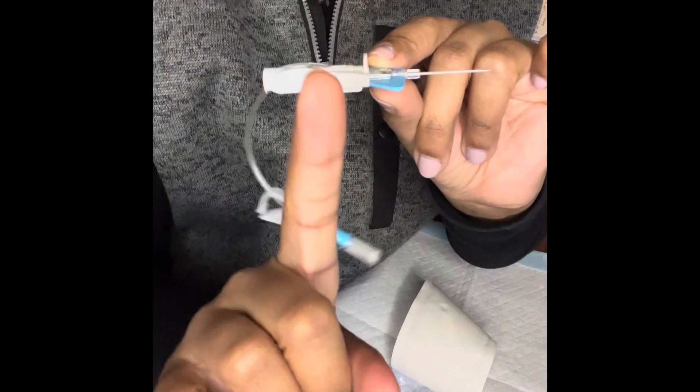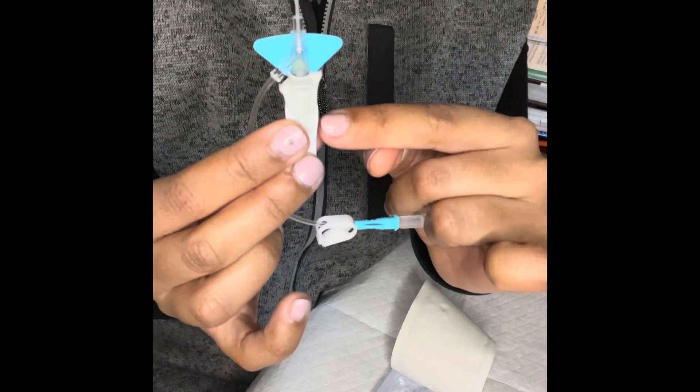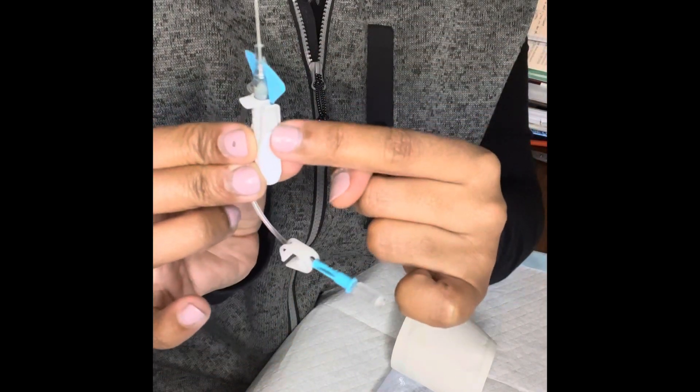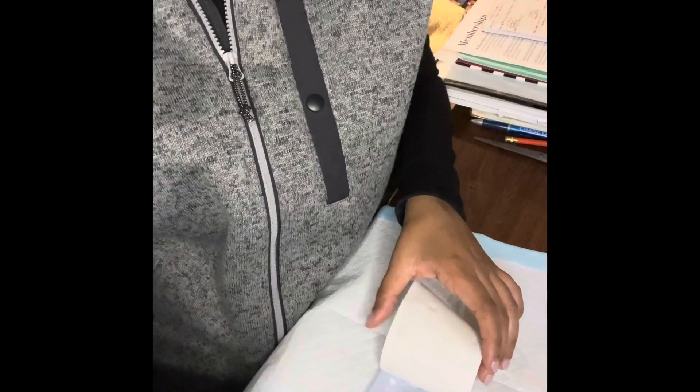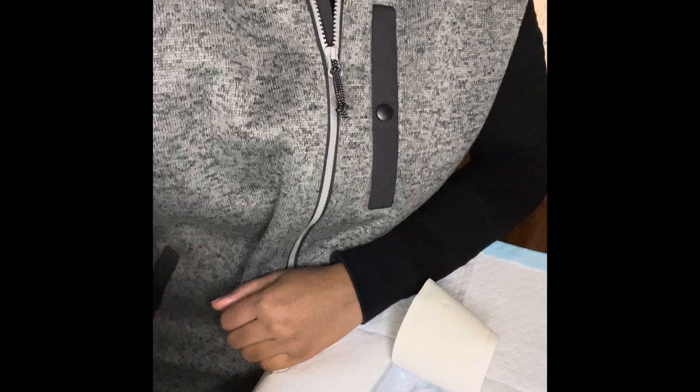During the sterilization process, heat and pressure combine and they cause some of the junctions of the catheter to be a little bit sticky. Breaking the seal can help you fight the resistance that you may be having when threading the catheter into the vessel.